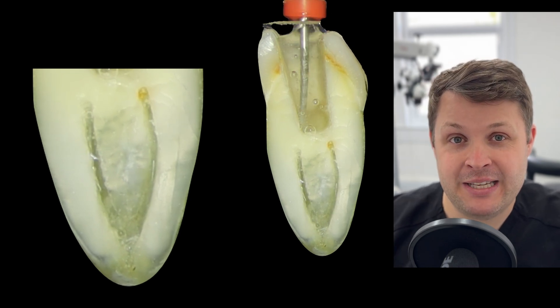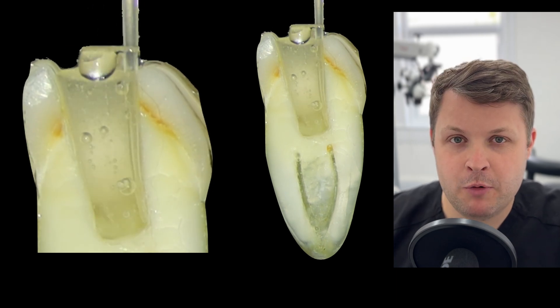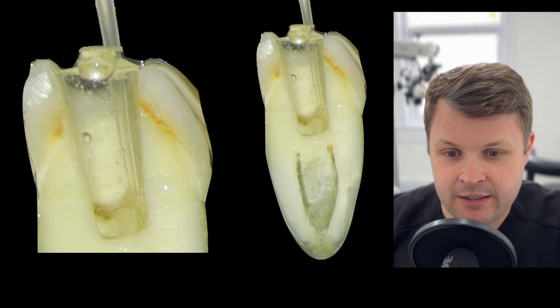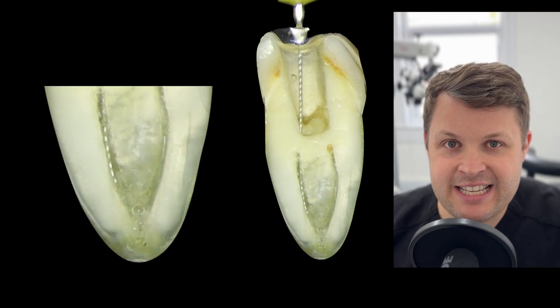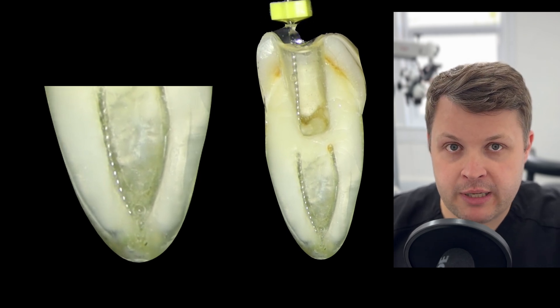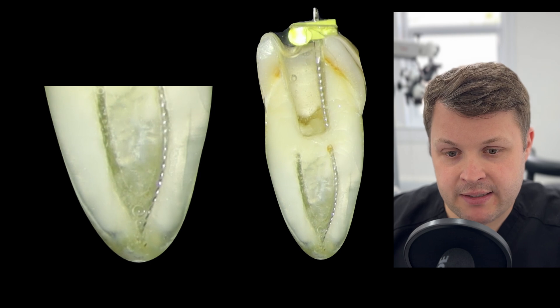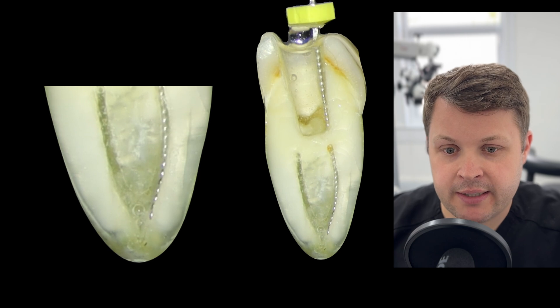Make sure you irrigate — you'll notice bubbles coming up, which means the hypochlorite is acting on organic material, dissolving and killing everything. That bubble effect is really nice to see. Once we've opened up the coronal third, I try again down the buccal canal with a size 10 K-file and it's still getting a little bit stuck, so I abandon that and try down the lingual canal, which is now reaching the apex.